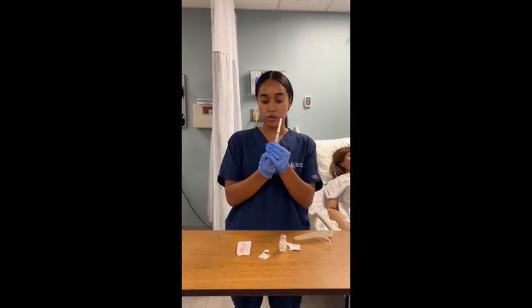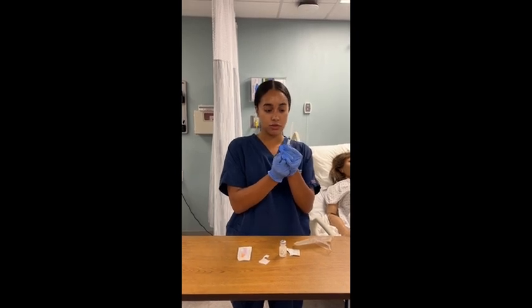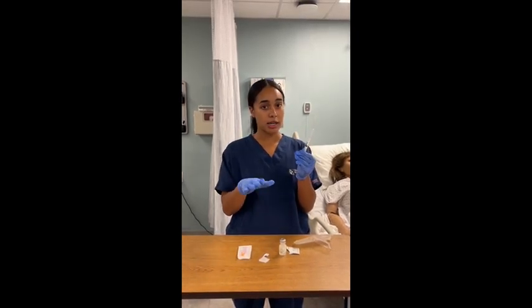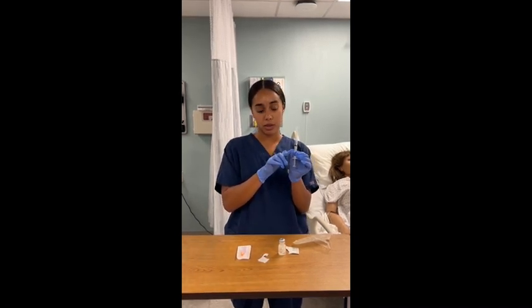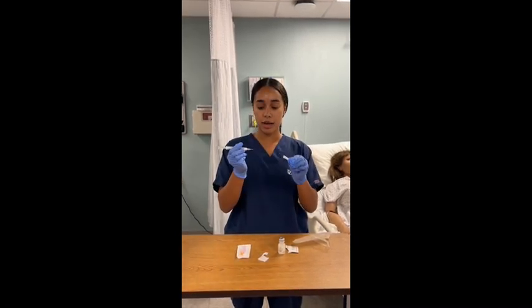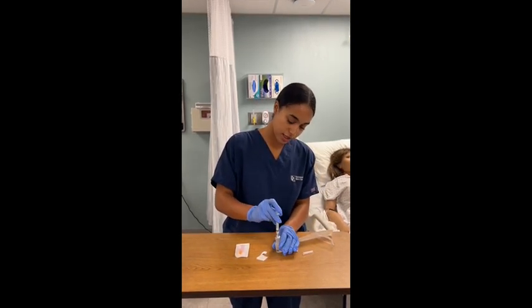I'm going to pull back and draw up. I'm just going to do one milliliter just for reference, but you'd want to check your MAR and make sure you have the right dose that you're drawing up. So you want to pull back one milliliter of air, take the cap off, and inject it into the vial.